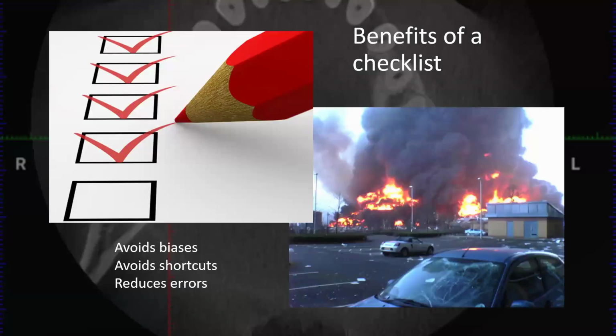And early on, I used a checklist. Now I have the checklist just kind of memorized in my head of what I go through, and I have it broken out into four different anatomical structures. That's the oral structure, the oral cavity, which I said I spend the bulk of my time on. Paranasal includes maxillary sinuses, ethmoid air cells, the sphenoid sinuses, and all their drainage pathways. The skull base is another one, the base of the skull, if you can see the foramina, the orbits, into the cranium. Obviously, you have to look as high as it goes.